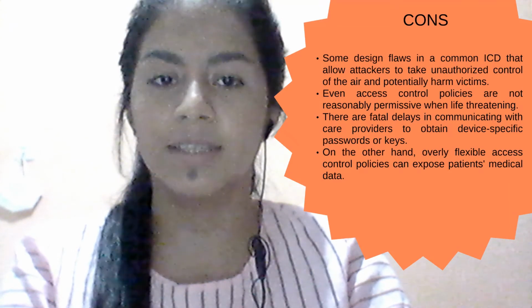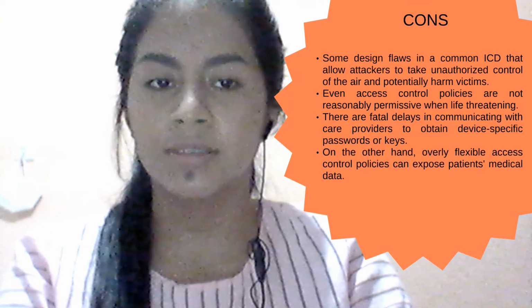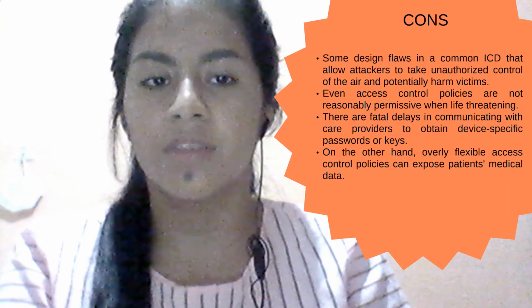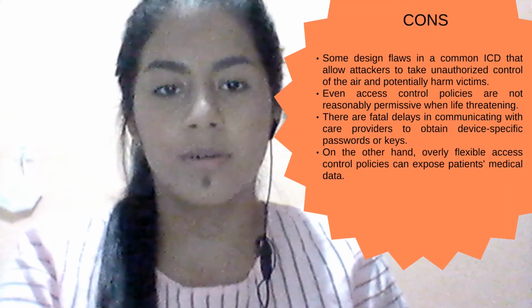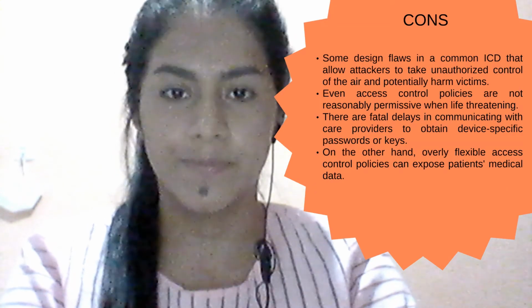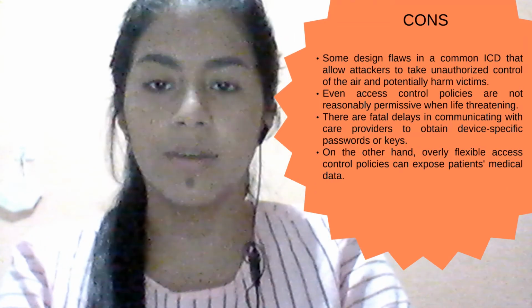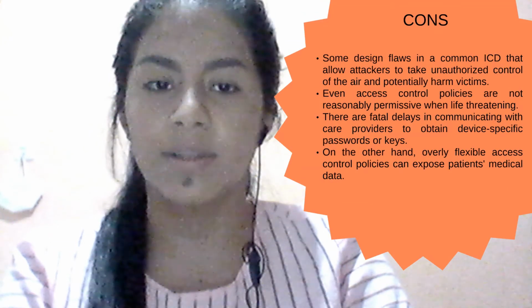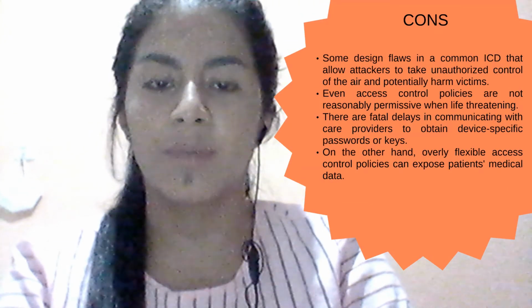They are fatally delayed in communicating with care providers to obtain a device-specific password or keys. On the other hand, overly flexible access control policies can expose patient medical data.